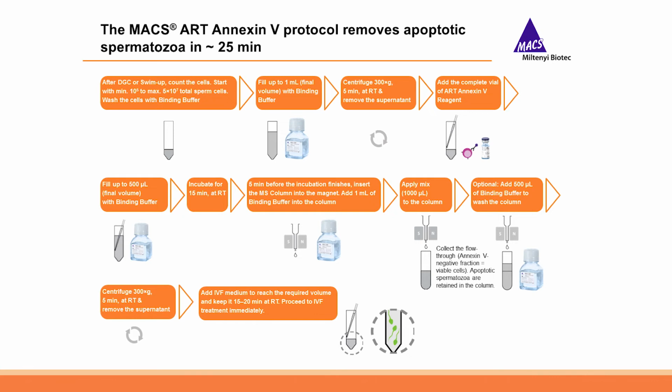Here you have an optional step to add another washing step with the binding buffer by adding approximately 500 microliters. This step is optional because in case you start with a higher number of total sperm cells, you would like to elute more. But if you are afraid of diluting the sample, for example, you can definitely skip it. Then you would proceed to the last centrifugation step, which is again performed at 300 G for 5 minutes at room temperature, and you can remove the supernatant.